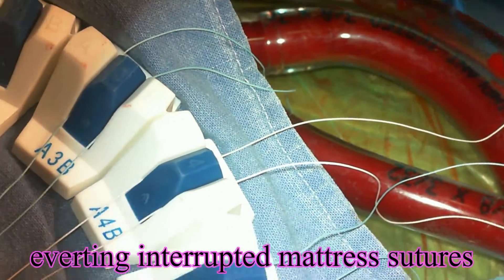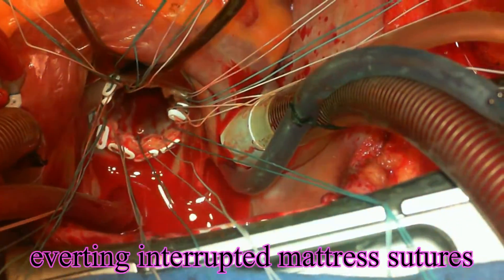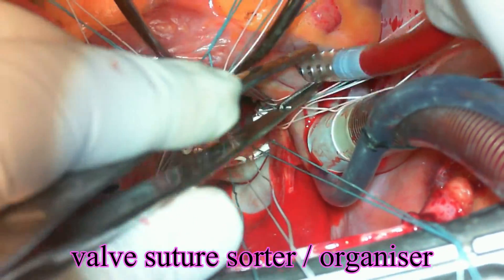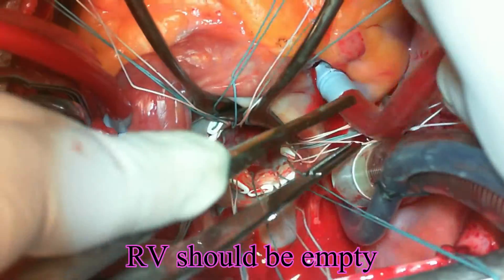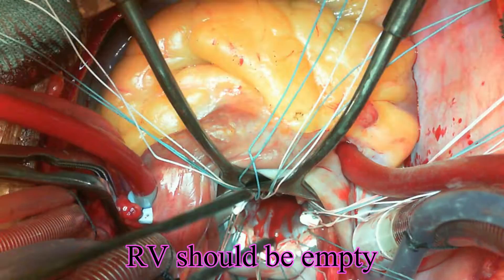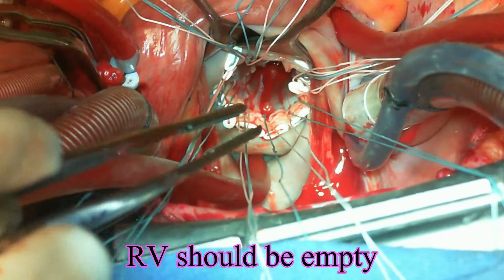After having excised the valve and placed the everting interrupted pledgeted mattress sutures along the mitral annulus, I'm trying to empty the right ventricle here by making a small hole in the right atrium, as valve placement would be a bit difficult otherwise.